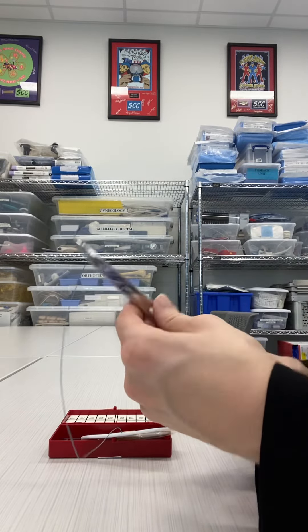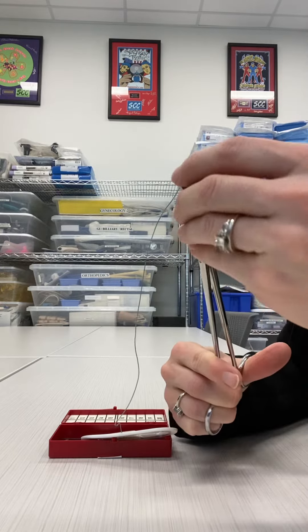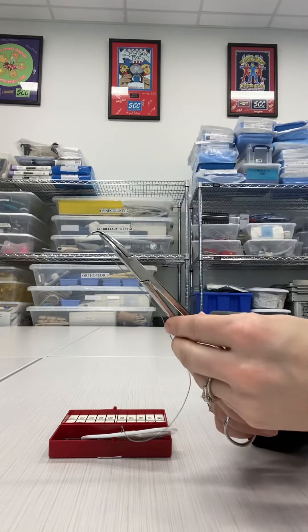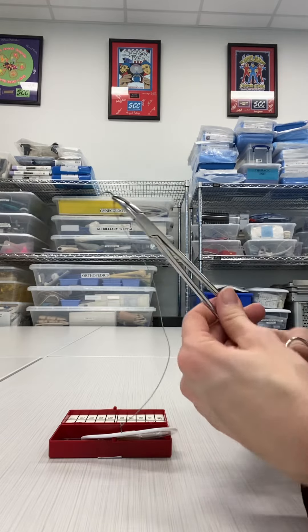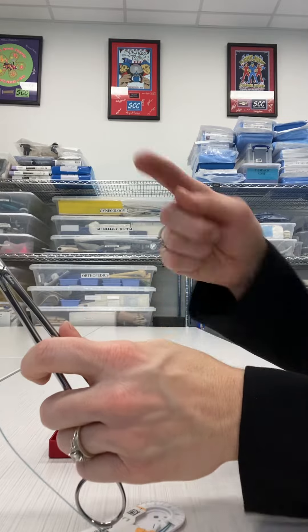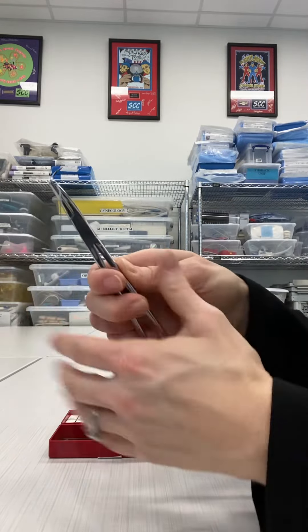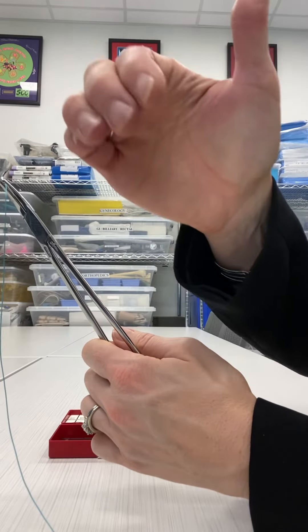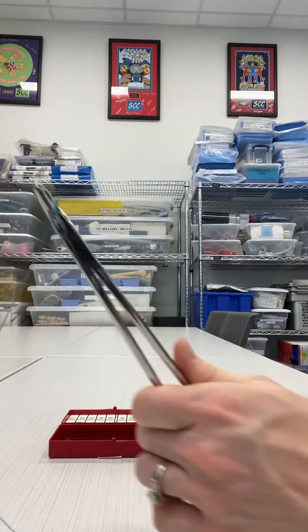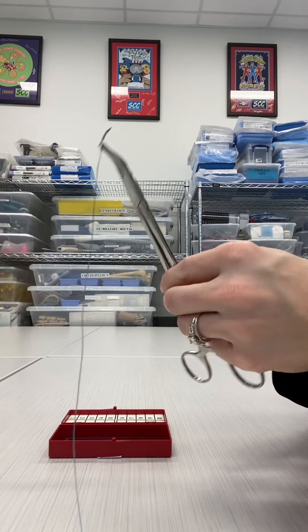If you want to load it for a left-handed surgeon, you will load it for a right-handed surgeon and then take that needle and flip it away from you 180 degrees so it is facing away. Then take it and put it in your left hand. You will have the tip coming to the midline to the right, the suture coming out to the left, and the curve of the needle holder going away from the midline — ready for the surgeon to take a stitch with their left hand.